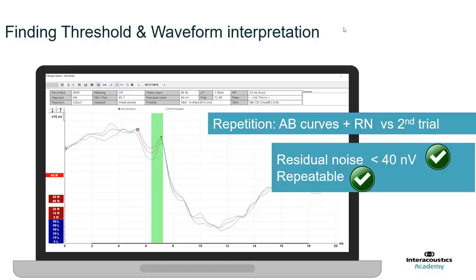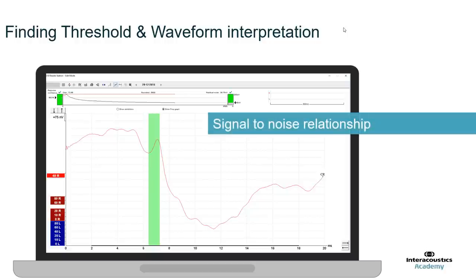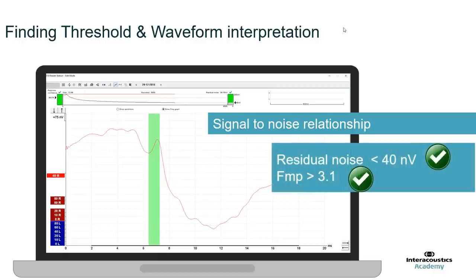Lastly, we need to look at the signal-to-noise relationship. You could look at the difference between A and B curves and estimate how much noise is present. Alternatively, you could mark the wave 5 marker and the trough of wave 5 and the Eclipse will make an estimation. But the easiest way is to use the FMP. For this adult ear, the FMP is greater than 3.1 and the residual noise is lower than 40 nanovolts — so the criteria are met and this is confirmed as a true ABR response.